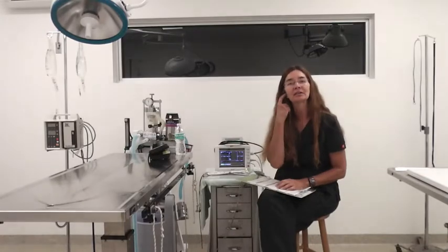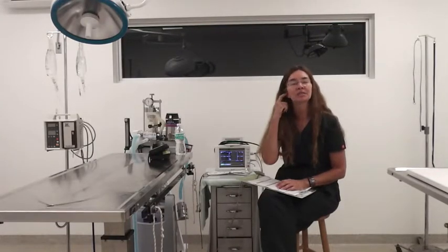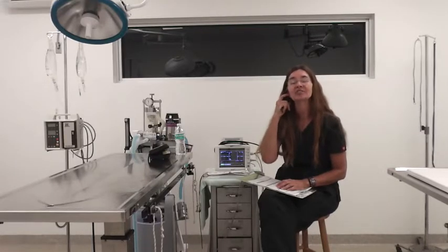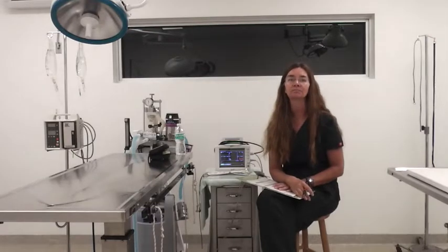Another reflex is the ear flick reflex. This happens when you touch the inner ear, just lightly, the little hairs inside their ears. When you do this, the ear will twitch. In lighter stages, it will twitch. During deeper stages of anesthesia, it won't flicker.